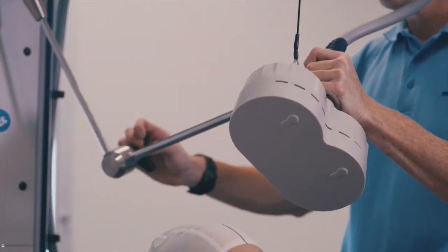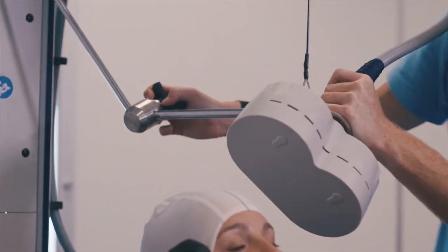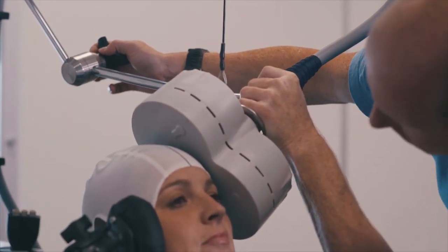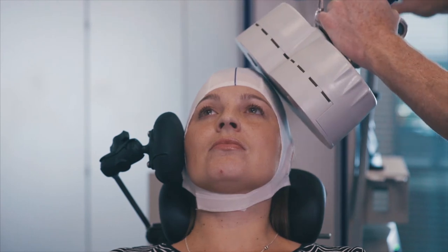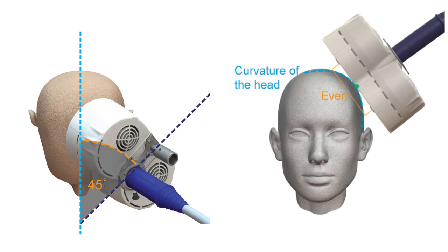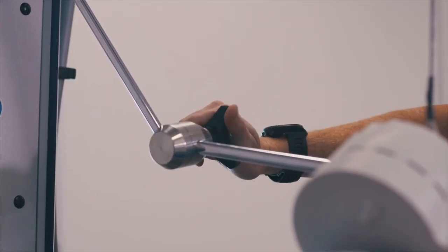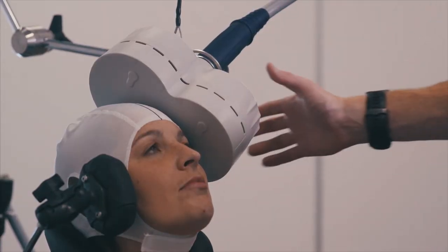Loosen the central locking knob to position the easy cool coil for treatment. Locate the recess on the underside of the coil and place this on your located treatment site. Adjust the angle so that the coil is at a 45-degree angle to the midline of the head, tangential to the curve of the head. Tighten the central locking knob to secure the coil, and check the coil is correctly placed with the head secured between the coil and the head side pad.